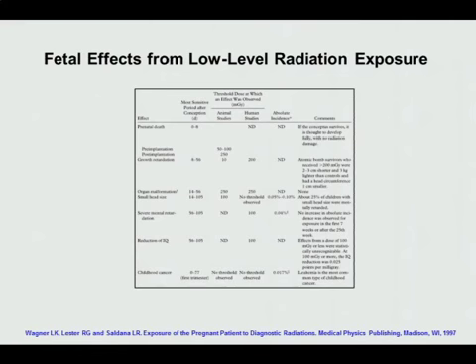This particular table is again taken from Dr. Wagner's book, which, reflecting back to the original curves or graphs I showed about fetal radiation exposure, discusses the different effects, for example prenatal death, what is the most sensitive part of the pregnancy from conception, what is the threshold required, and what are the comments. I find this table quite helpful when I'm trying to understand some of these fetal dose exposure effects.